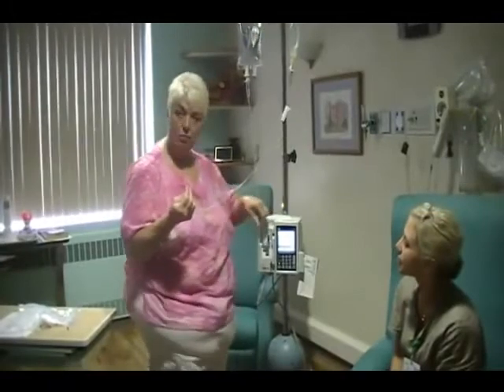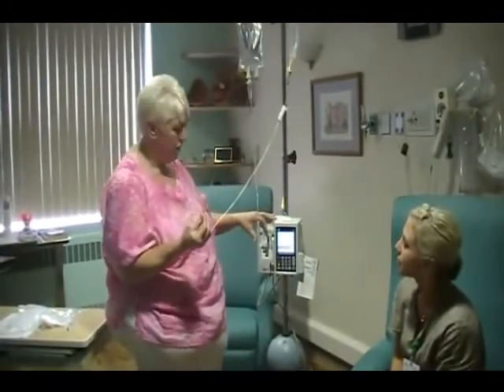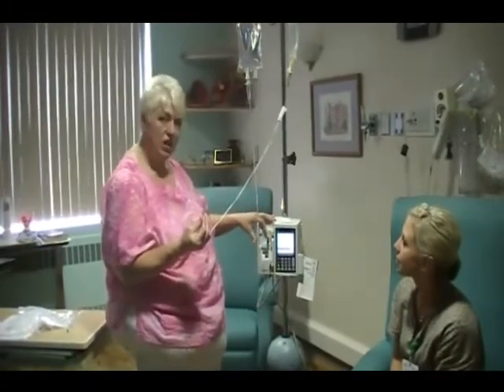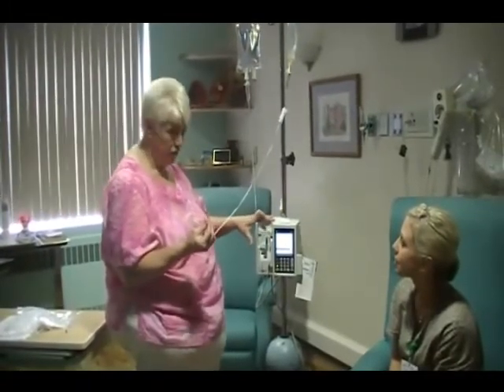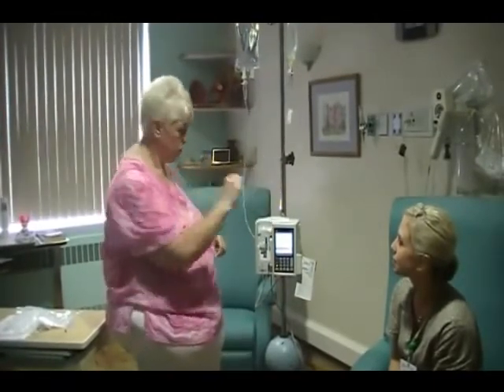The reason I had prepared the blue clave even though the doctor hadn't ordered antibiotics yet is that this patient's in the hospital for a reason, so I figure somewhere down the line they're going to need a secondary infusion of something, whether you do it with a syringe or with a tubing.